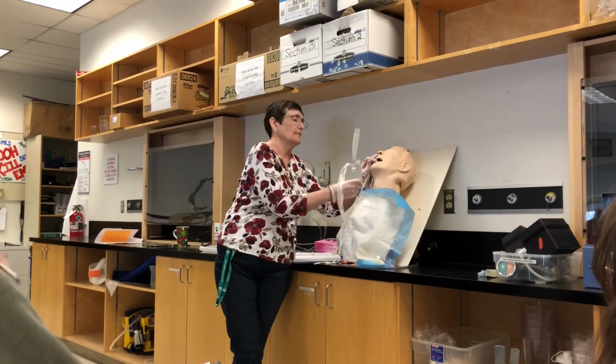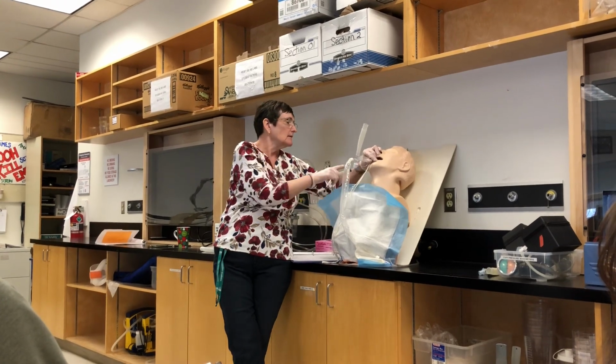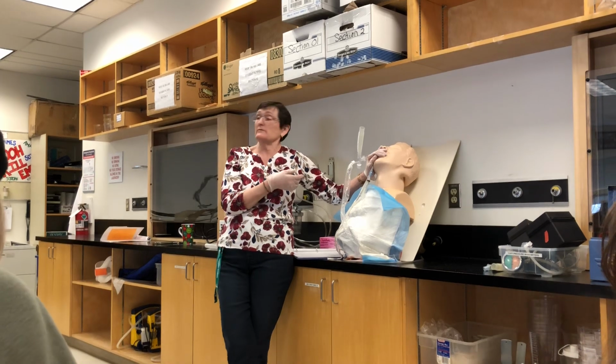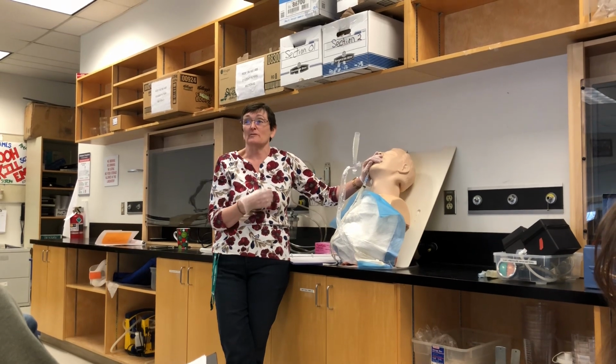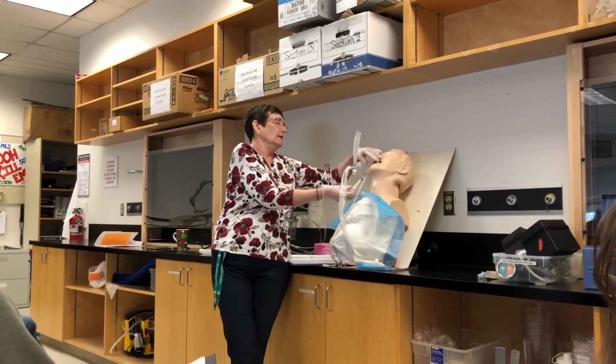All right, so we've got ties undone. I'm going to explain the procedure to our patient. Mr. Smith, I'm going to get you to take 3 big breaths. On that 3rd breath, I'm going to pull the tube out. After that, you're going to be coughing quite a bit. And he nods his head knowingly.